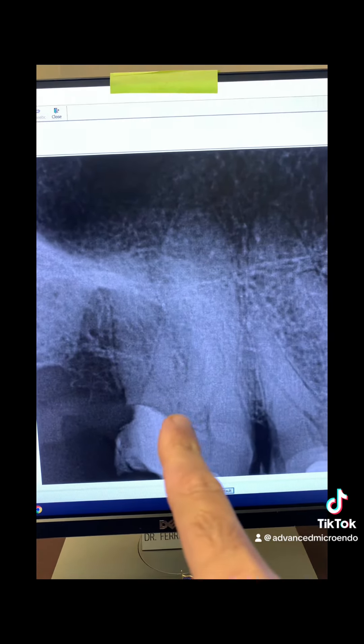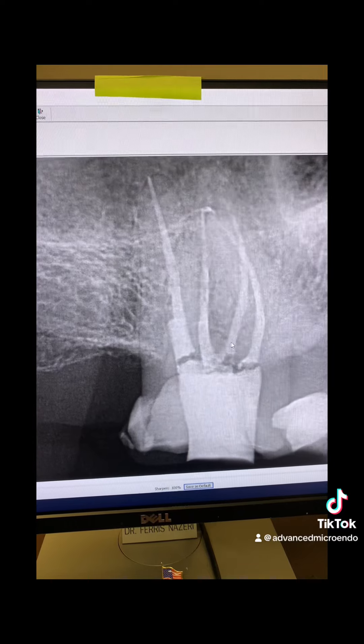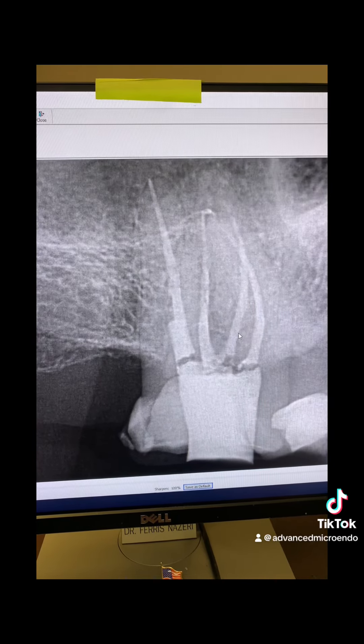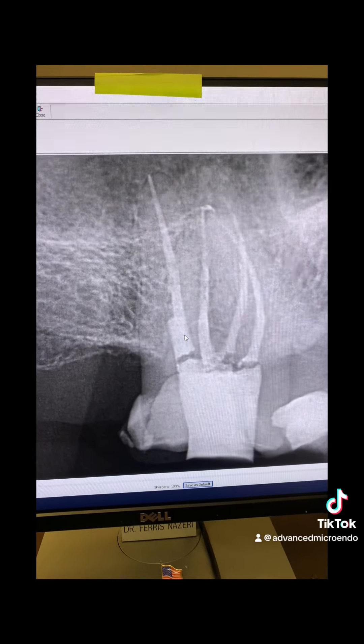On tooth number two — the very last tooth on the upper right side — here's the pulp stop. Four canal systems. Upper second molars can also have an MB2, so MB1, MB2, distobuccal, and palatal. These were 22.5 and 23 millimeter working lengths.